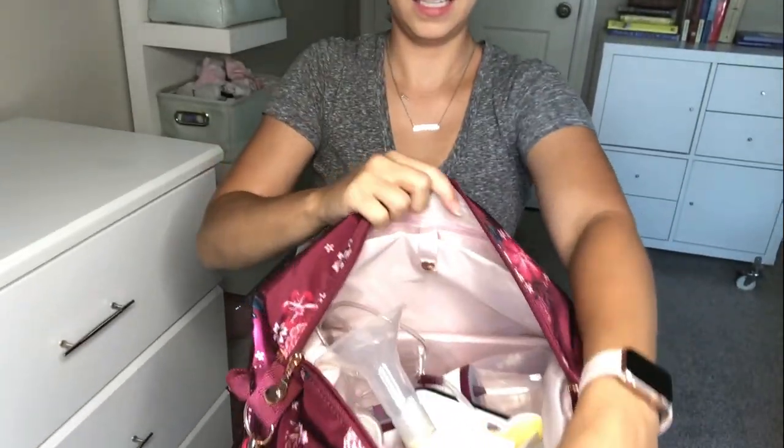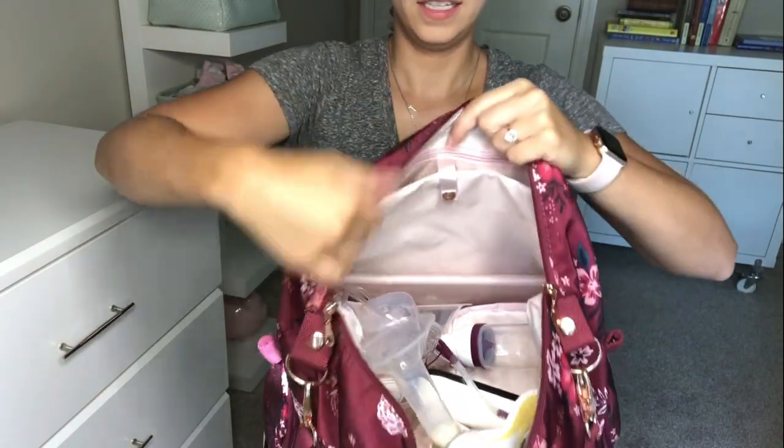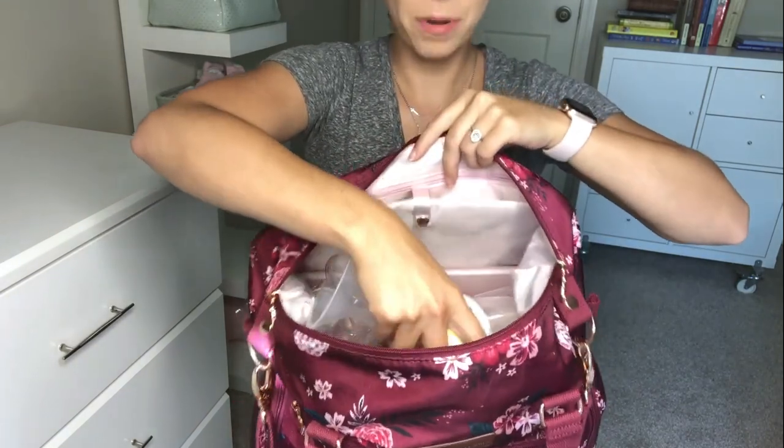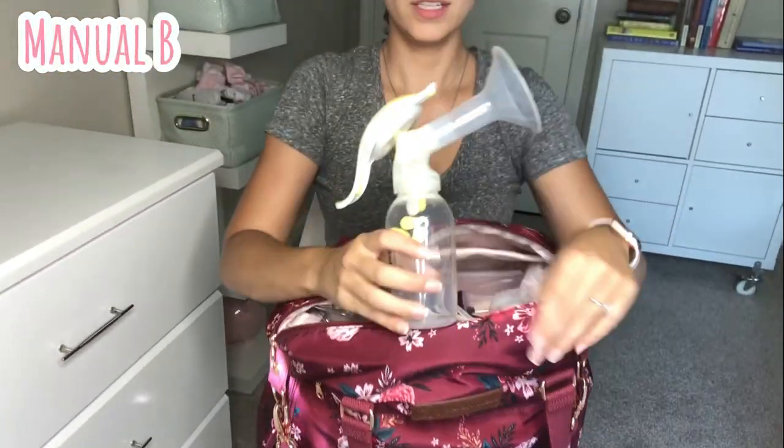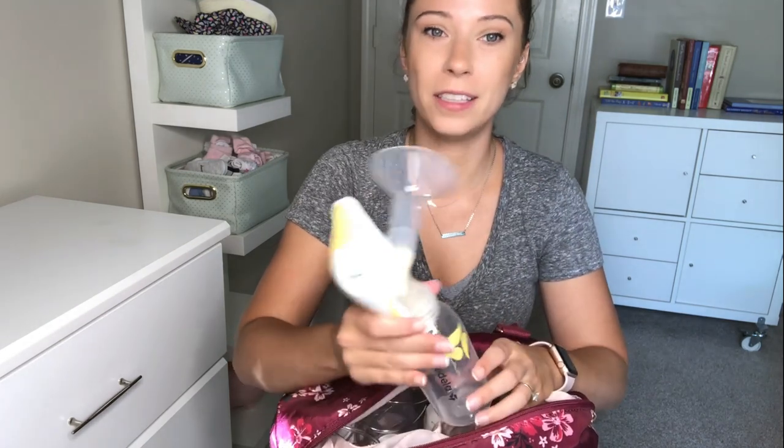In the little side compartment, I have a manual breast pump. It's super important to have one with you just in case your electric pump stops working while you're at work. You definitely don't want to go that many hours without expressing breast milk, and hand expressing could take forever. If you're on the clock, you want it to go fast, so always have a manual breast pump because they always work no matter what.